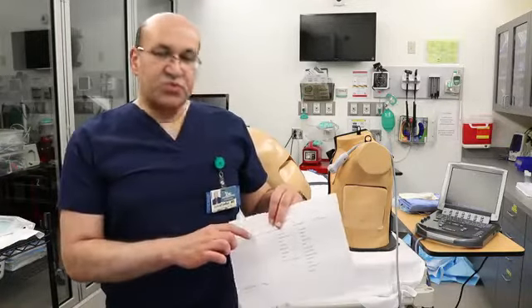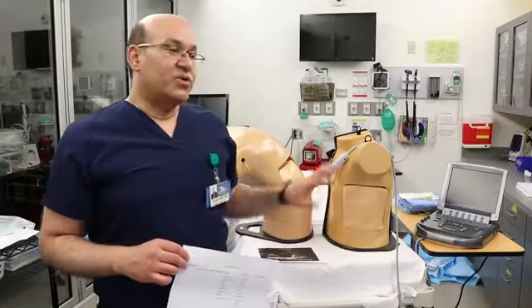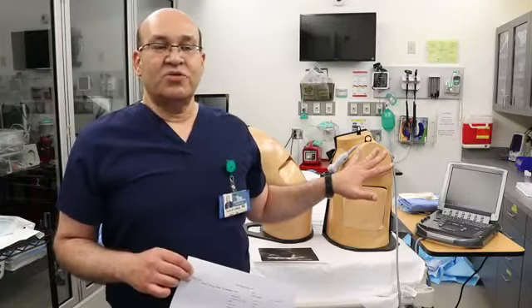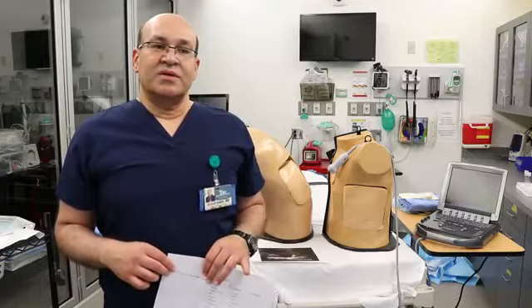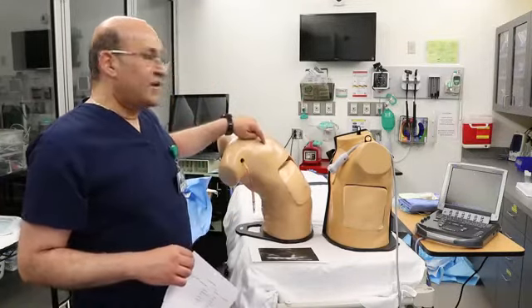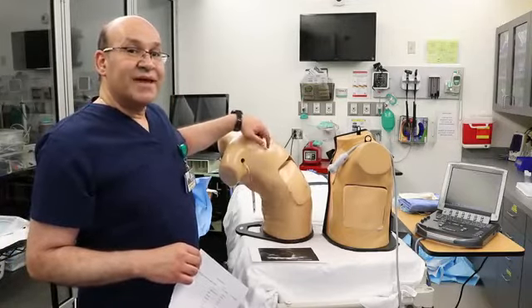Next step is to do the timeout. And timeout is patient name, patient birthday, and also something like the thoracentesis. You need to know in the timeout to tell what procedure you are doing, and also because we have right lung and left lung, you need to tell which side you are doing. So you need to mark the site. If you are doing left side, mark the left side and put your initials and the date of the day.